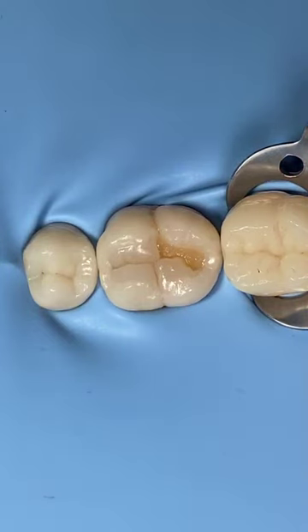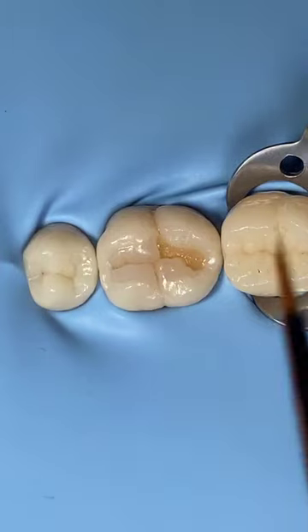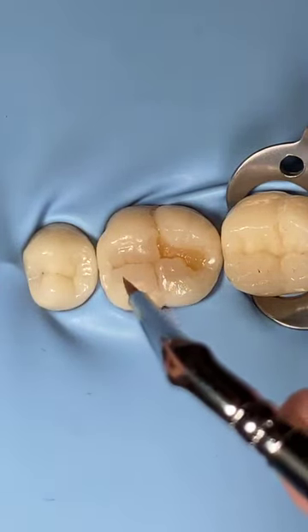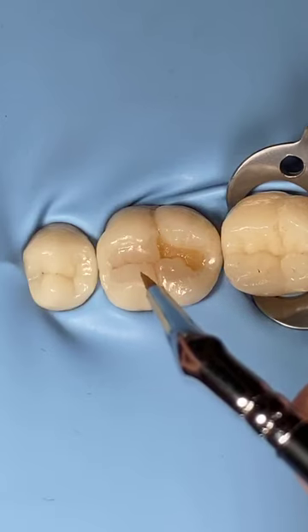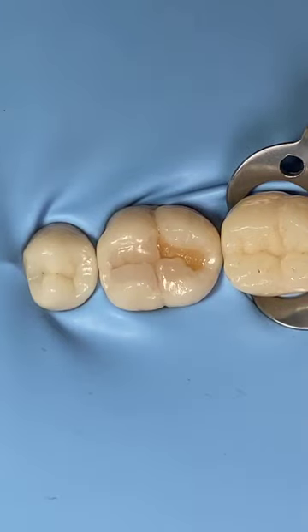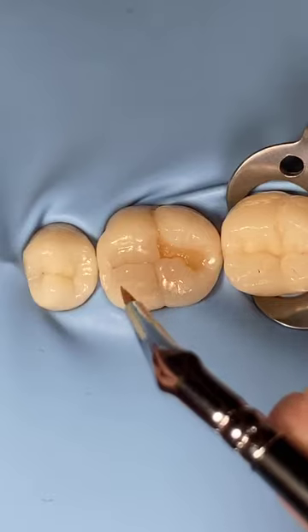What you need to do now is take your magic brush. You can dip it with the modeling resin, and then just touch it. Feel like when you are touching your son, your baby, your girlfriend, your wife. Just feel it, touch it gently. Remember the idea of creating gaps and making them close to each other, right? Until it's very thin.